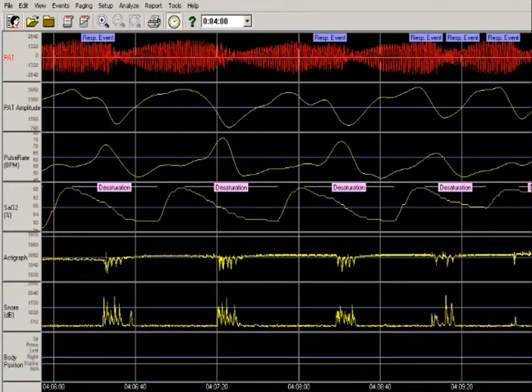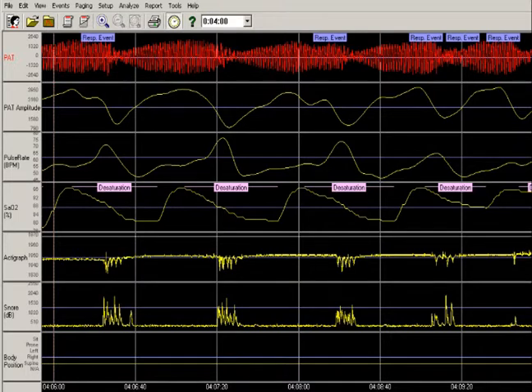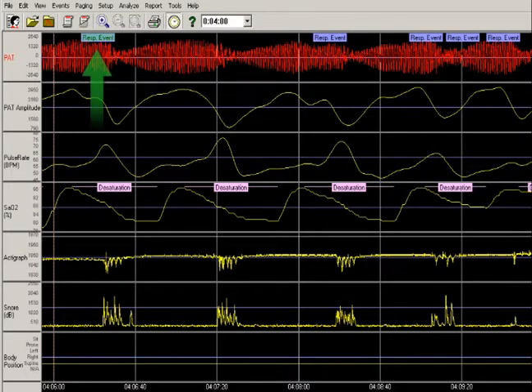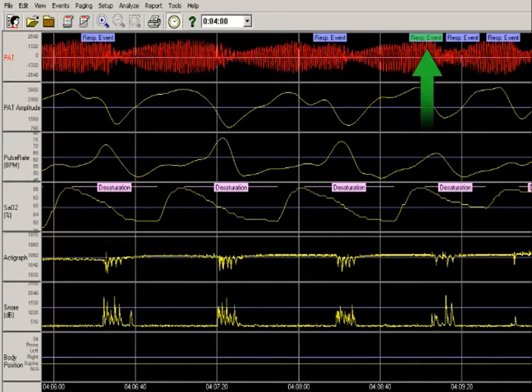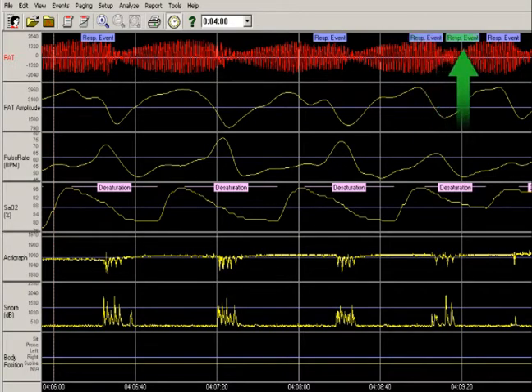Here is how the raw data can be easily analyzed and edited. Each respiratory event is detected and flagged on the screen.